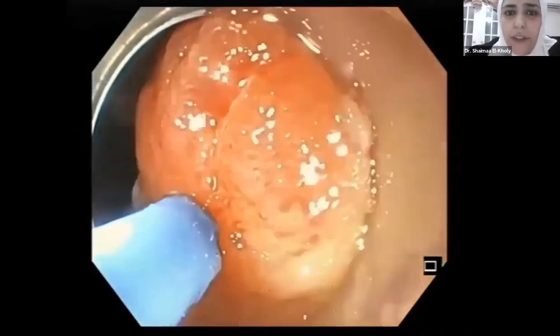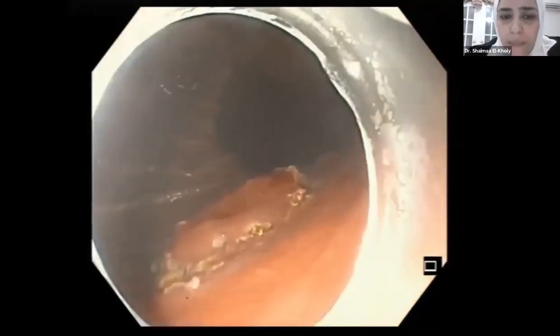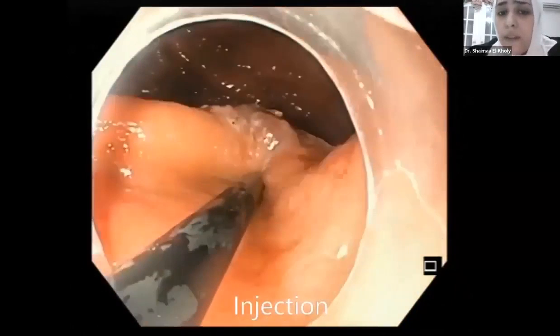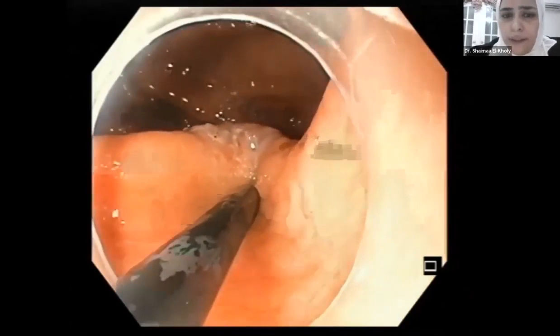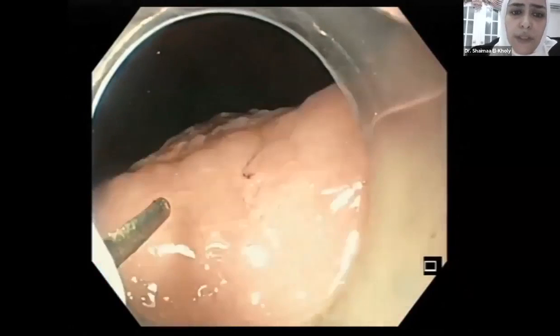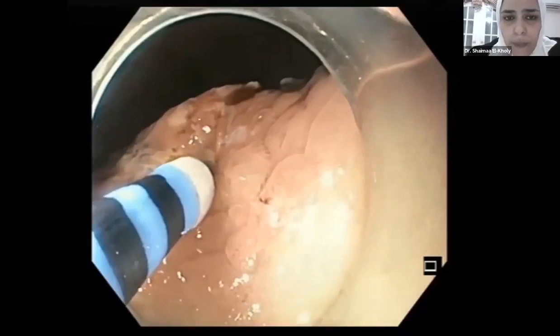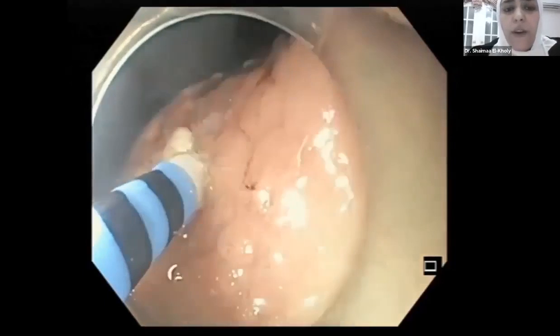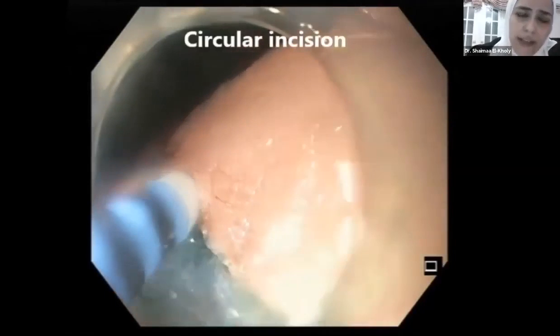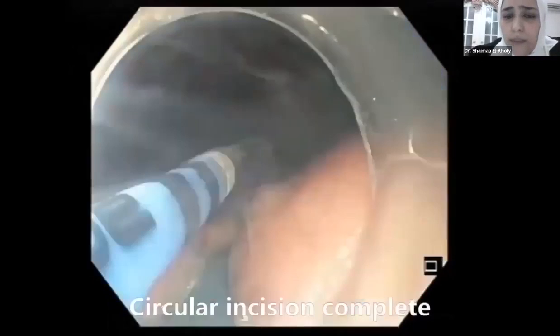You start to mark the lesion, and afterwards, here's the marking complete. And afterwards, you start injection. We use methylene blue mixed with saline. After injection, we get the knife we will dissect with, and we start doing the circular incision. It's not mandatory that you complete the whole circular incision. You can leave a final part till the final dissection. And here you can see that we are performing the circular incision and it's almost complete.